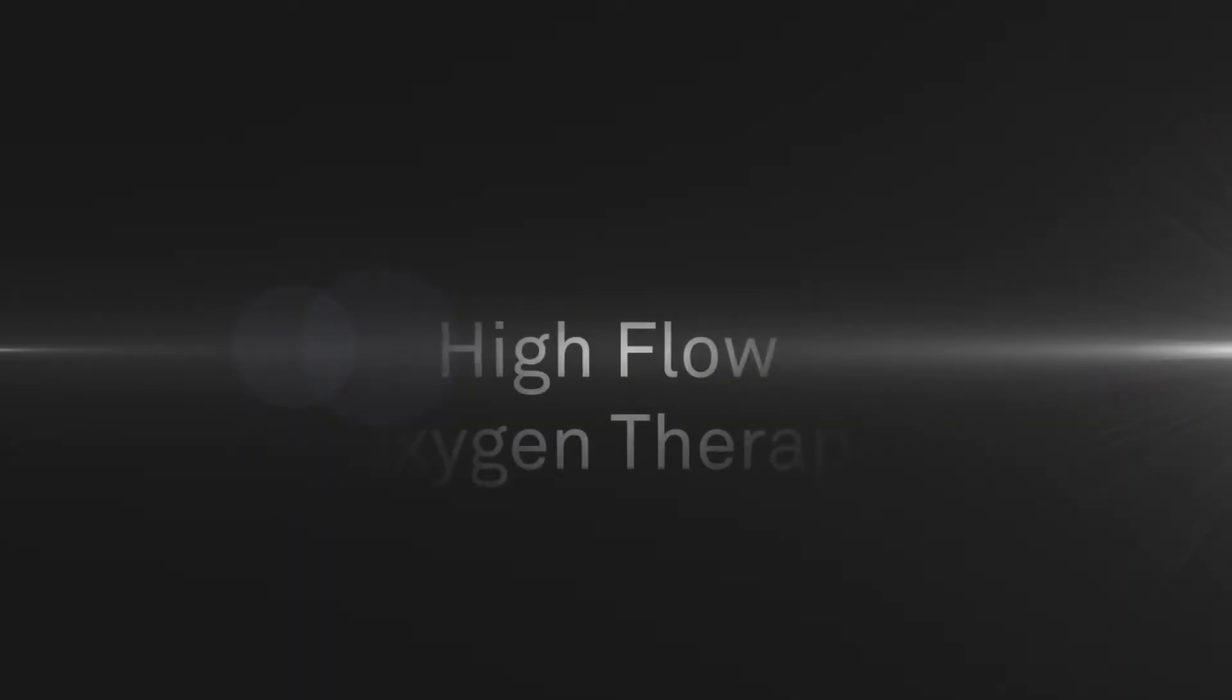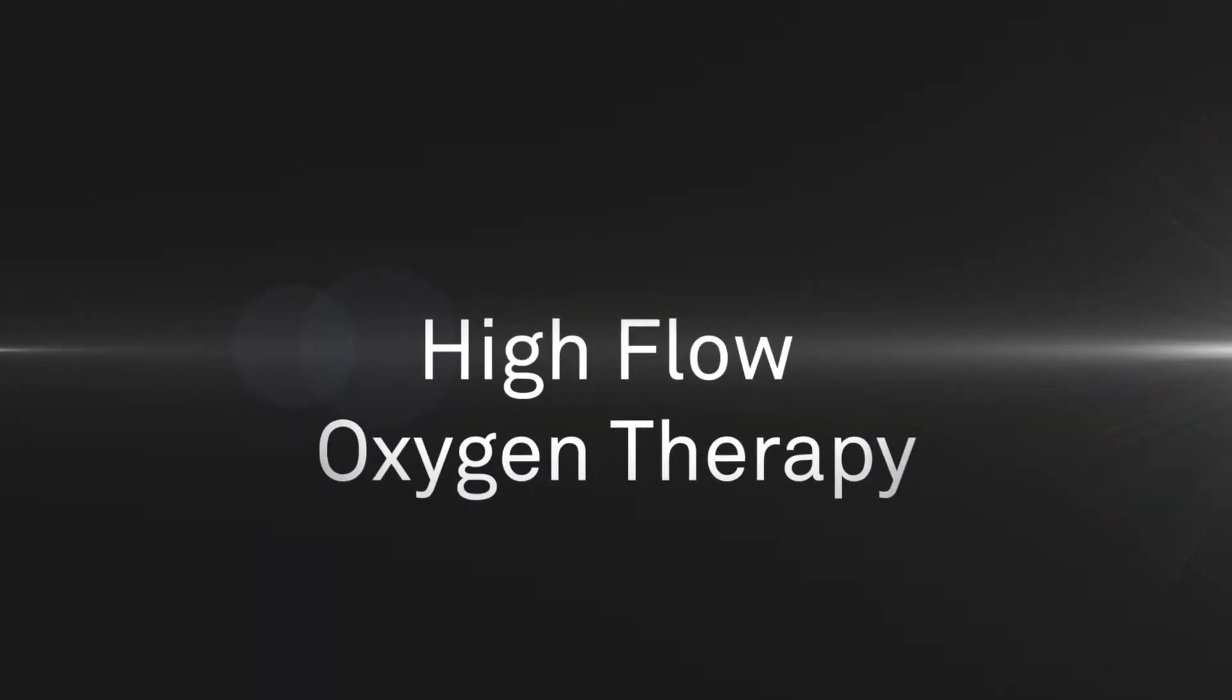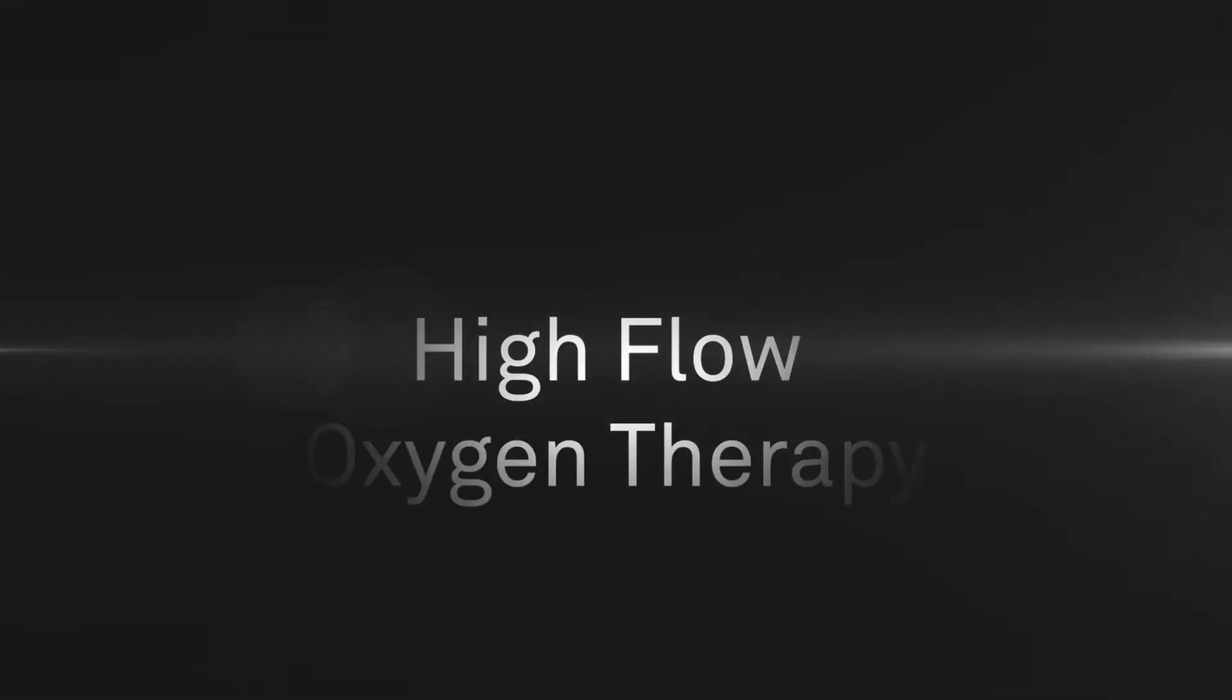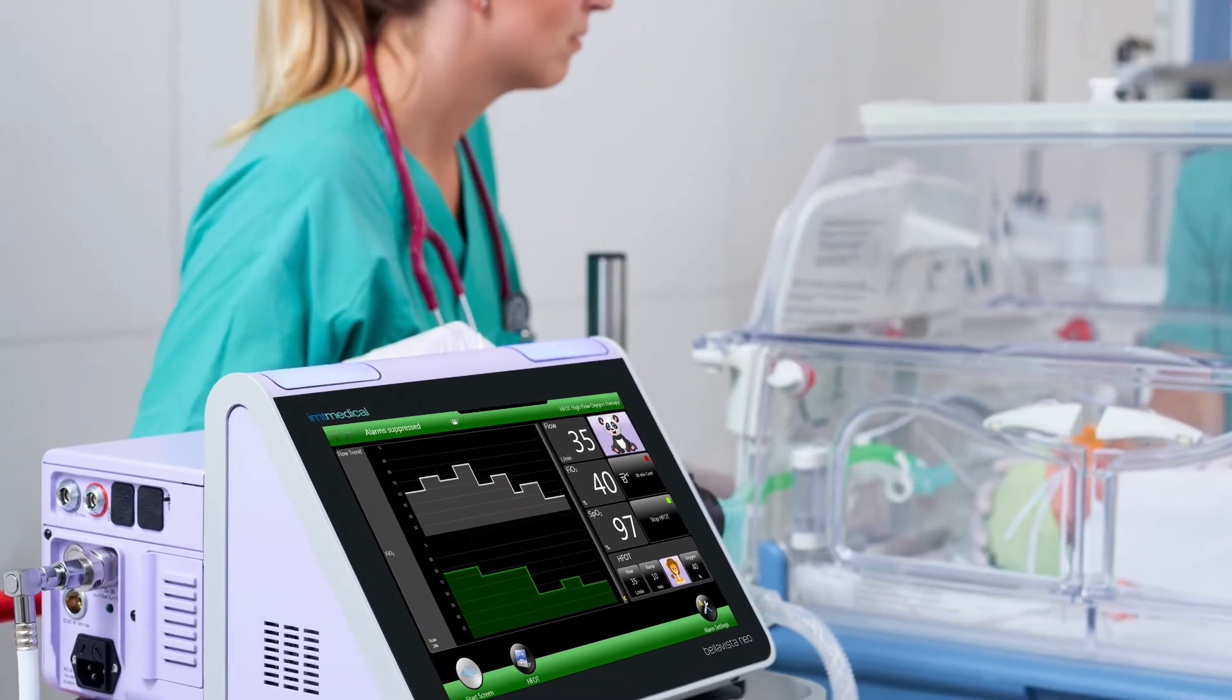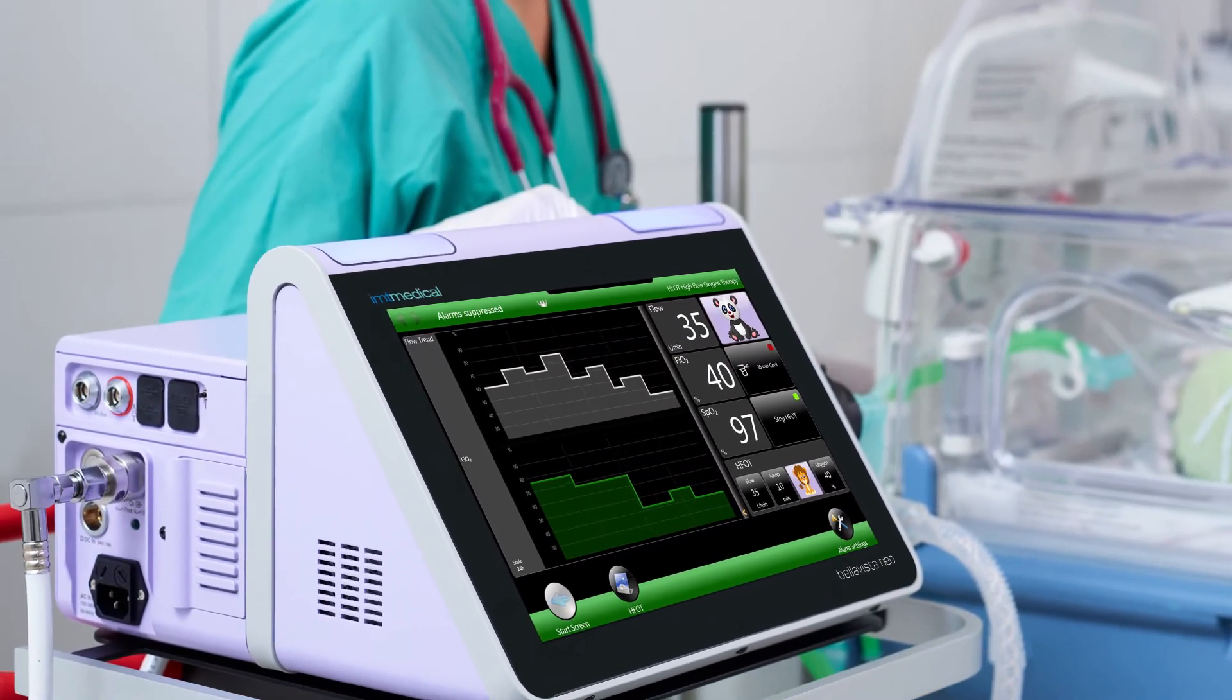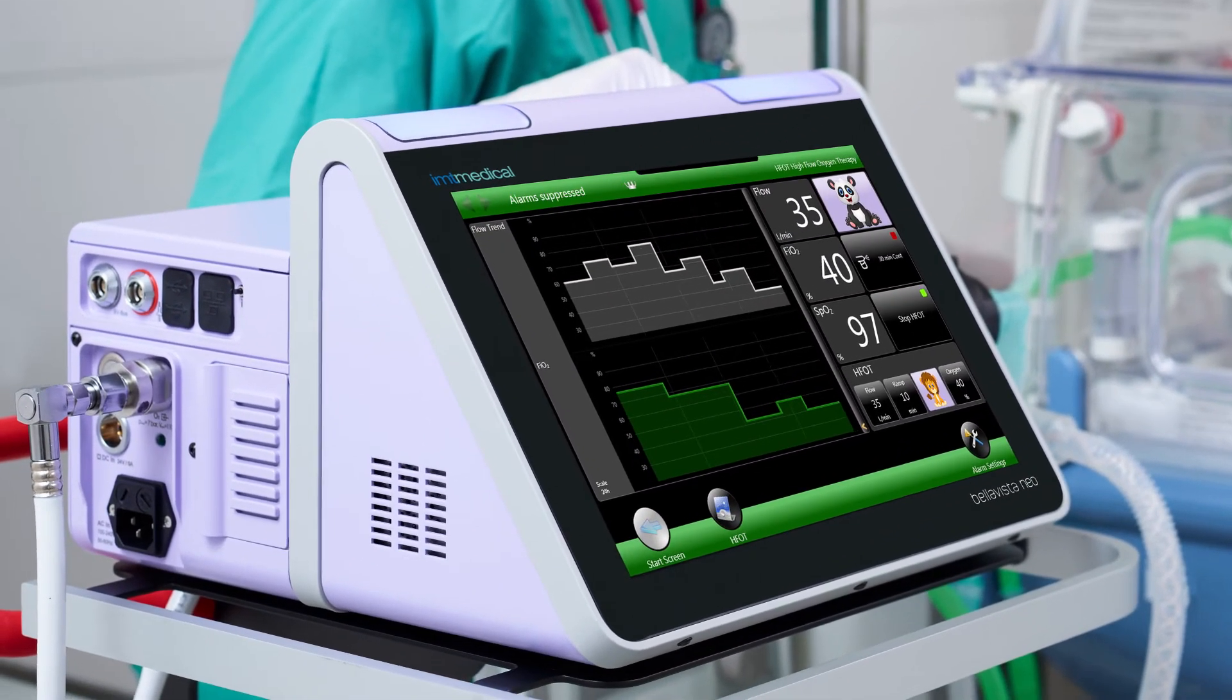The high flow oxygen therapy, our latest BellaVista ventilation tool, reduces the work of breathing thanks to flow rates higher than traditionally delivered in oxygen therapy.